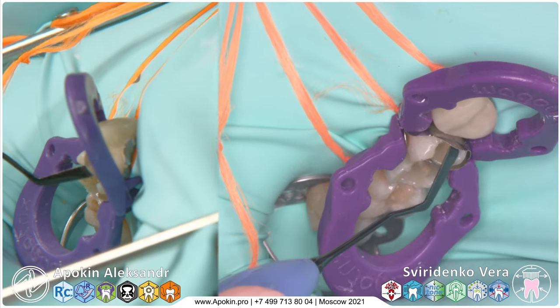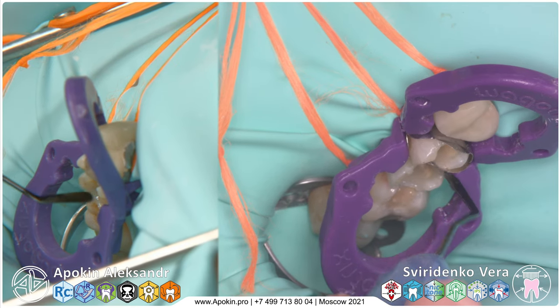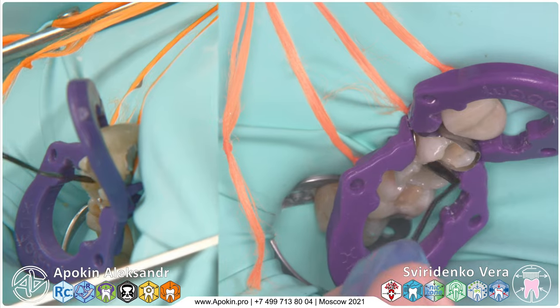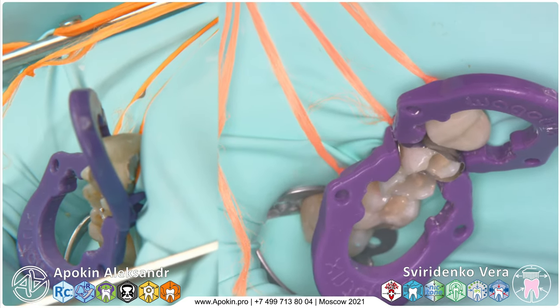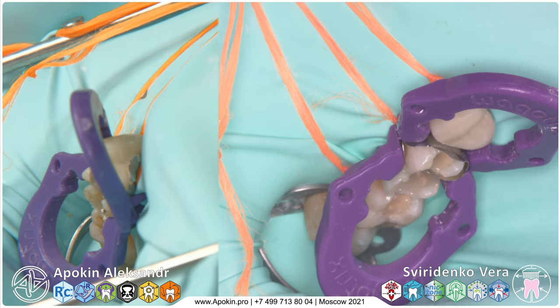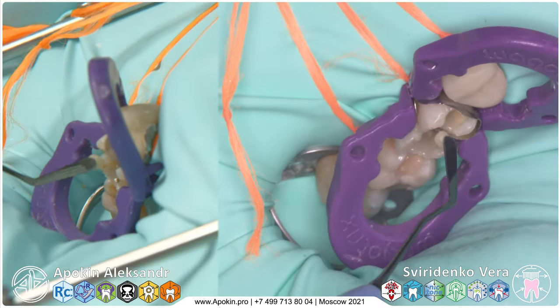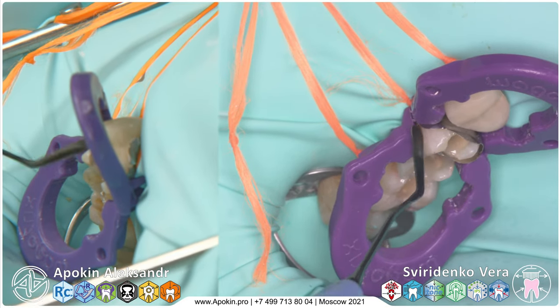Checking the margins in occlusion, occlusion plane. Remove unnecessary parts of composite. Press some parts of composite with the micro brush to be sure that you place it correctly.